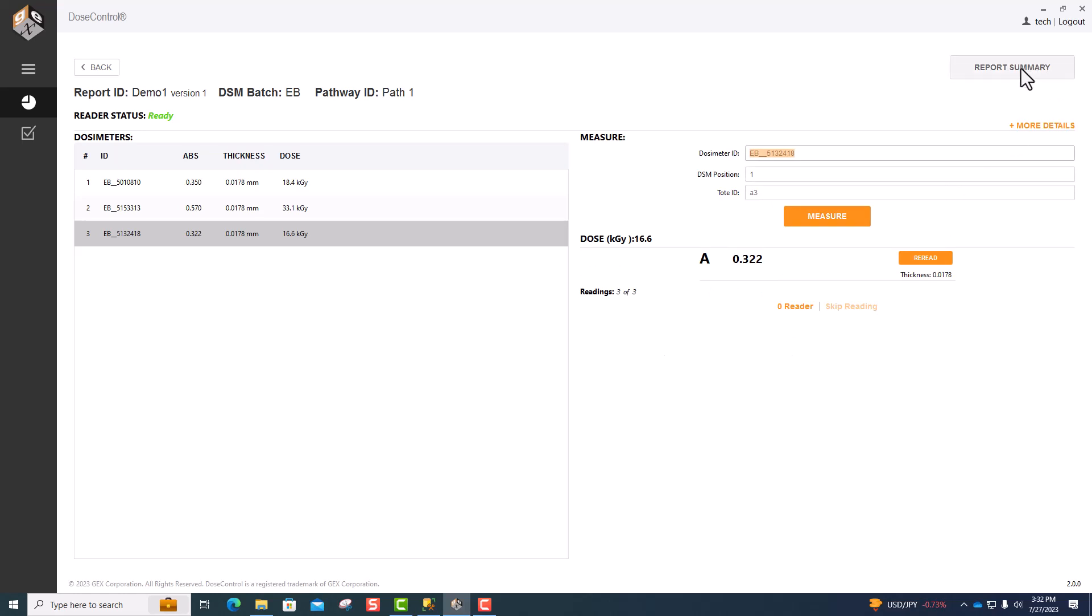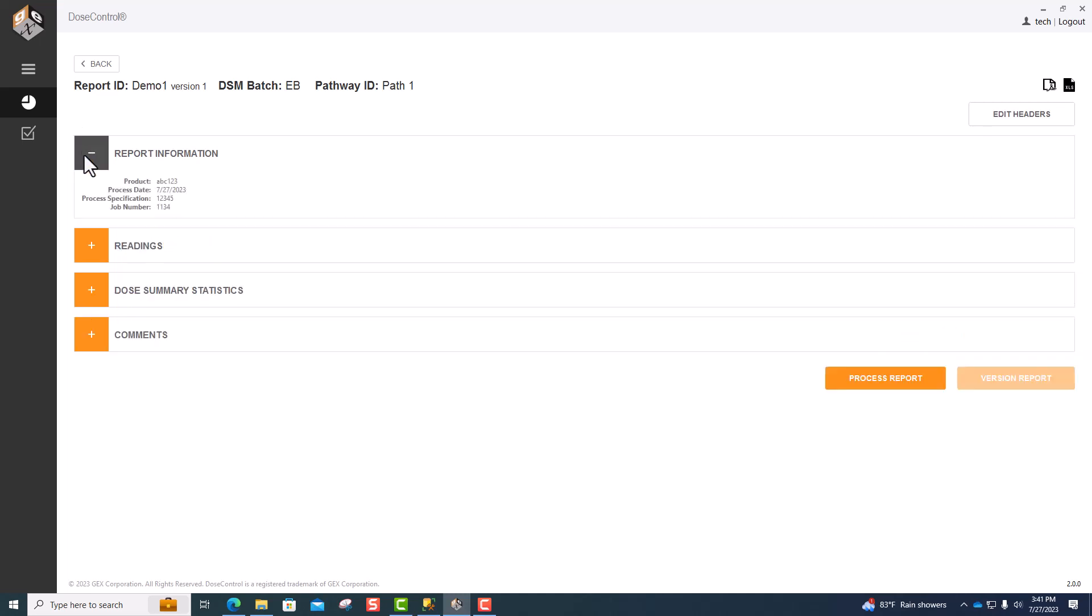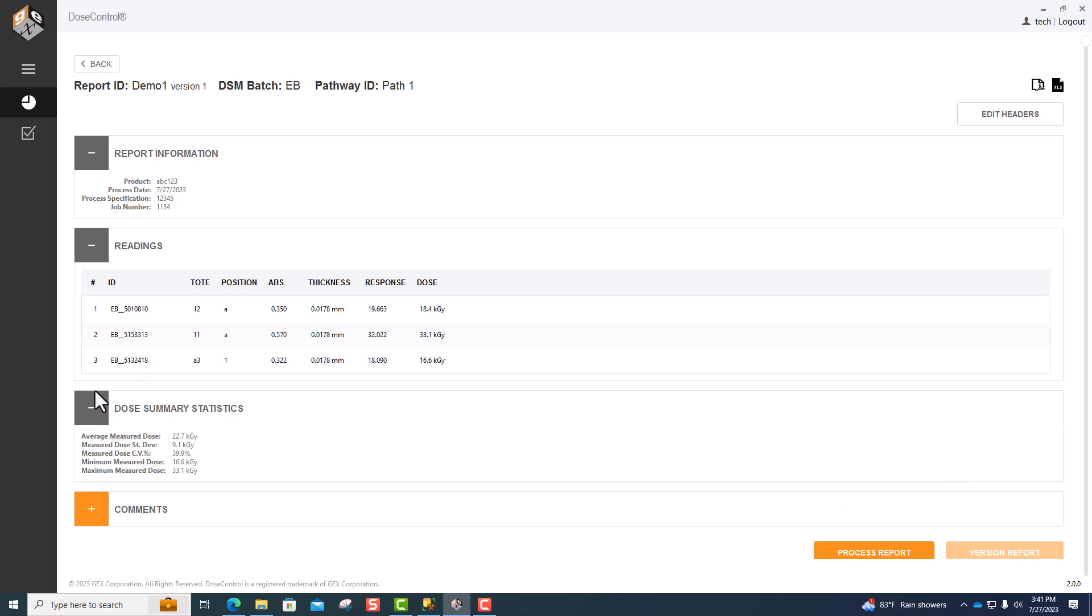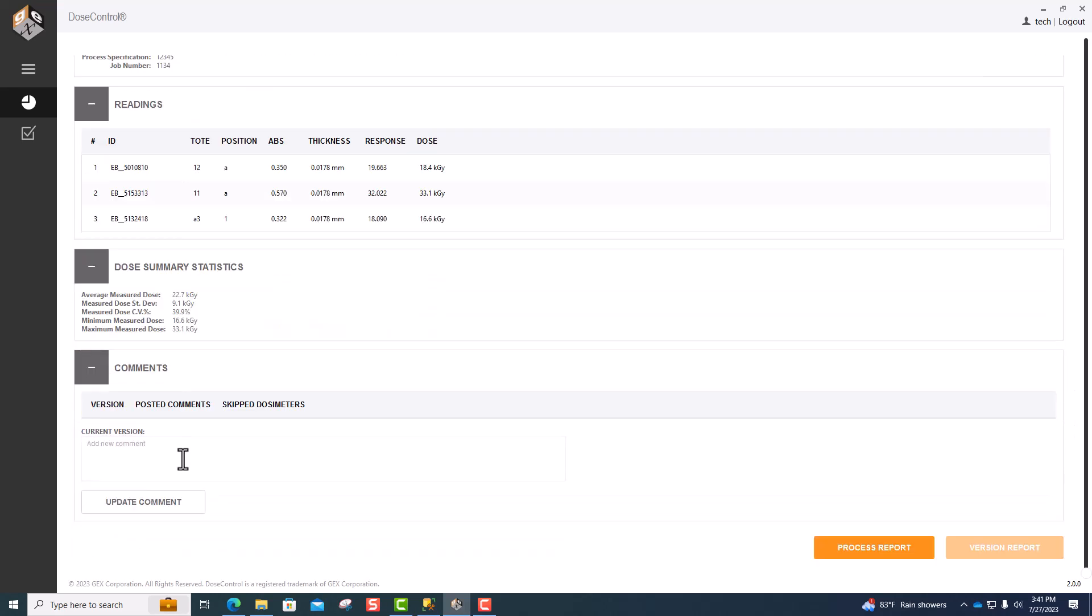Once you're done, go to Report Summary. On this page, you can view the report information, the readings that were taken, your dose summary statistics, and if needed, you can add and view comments that have been added.